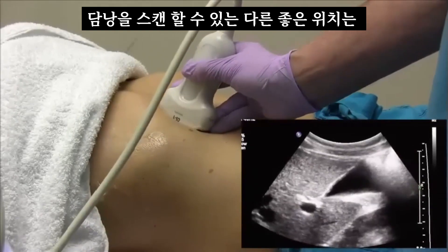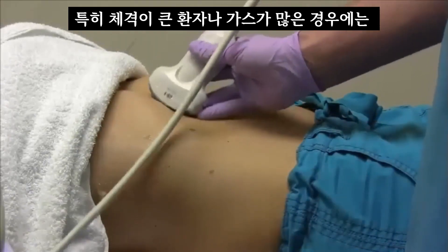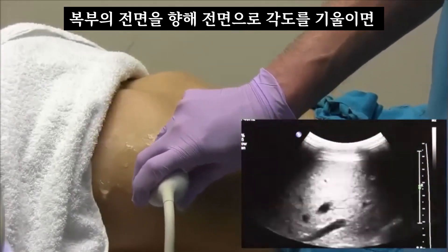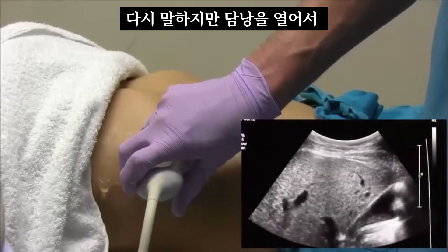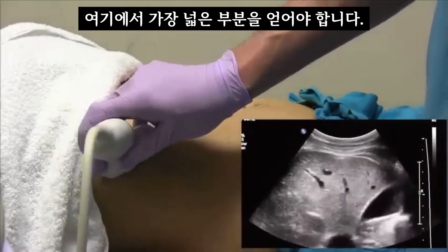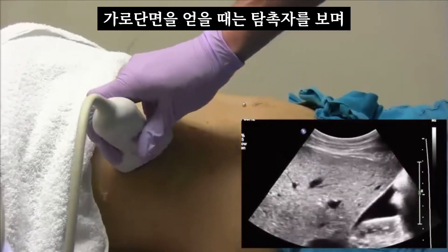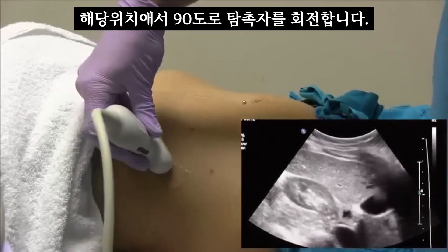Another good window for the gallbladder, especially for bigger patients or gassy patients, is to come intercostal and angle up towards the anterior part of the abdomen. Again, you're just going to open up the gallbladder to get its widest portion. Same thing — once you find that sagittal window, look at your probe and turn it 90 degrees to get the transverse plane.